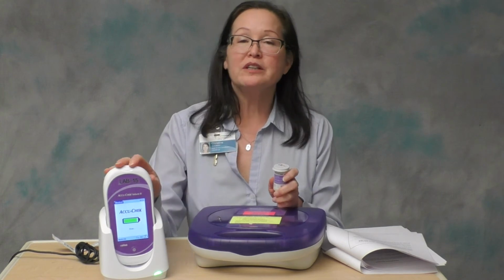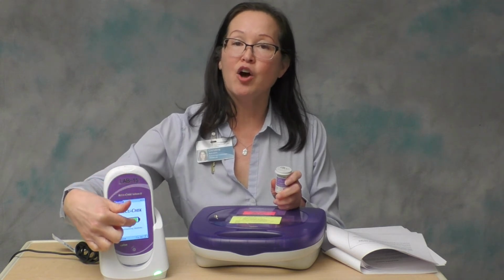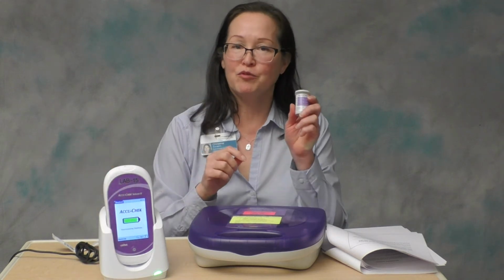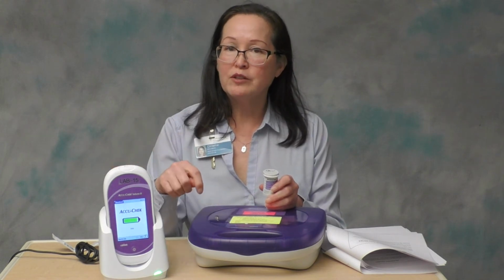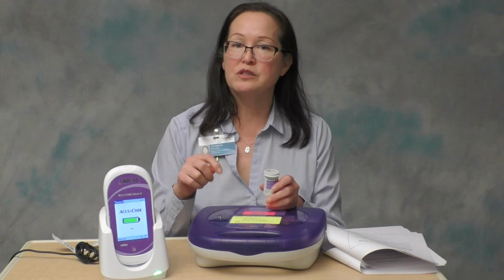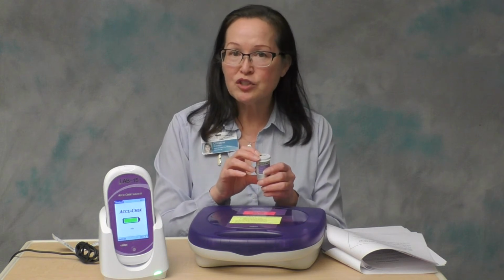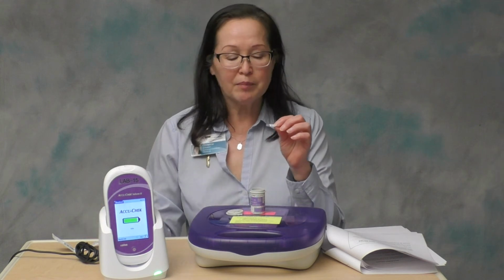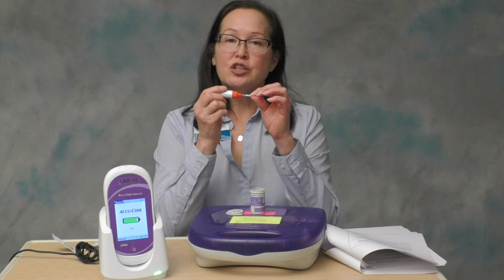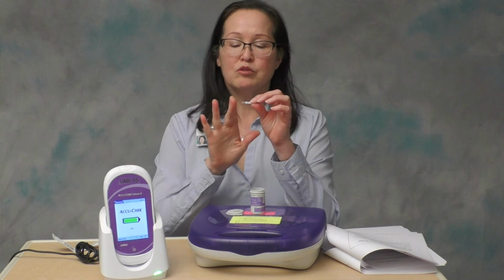So the test strips will be inserted into the meter prior to dosing. Wait until you see the strip icon showing you to insert into the meter before you take the strip out of the vial. And then you need to wait for a blood drop icon to appear before you dose the strip. You're going to apply the sample to the front edge of the strip, as I mentioned. I call it the KISS technique. So tip to tip, the front edge of the strip to the tip of the bottle or to the drop on the finger.